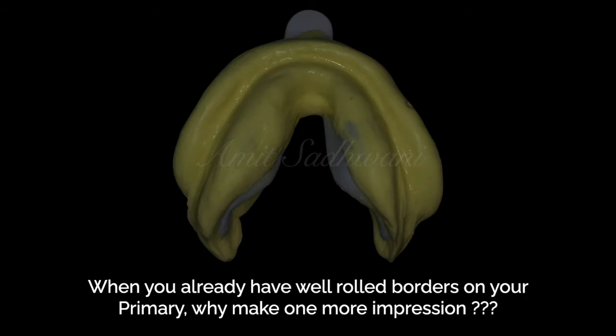Well, when you already have well rolled borders on your primary impression, why make one more impression? Primary impressions are usually made on stock trays, isn't it? Well, stock trays are bulk trays. They are not custom fit to the underlying tissues. Here is an impression made with alginate.